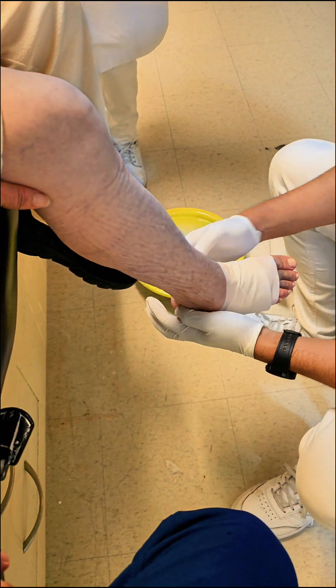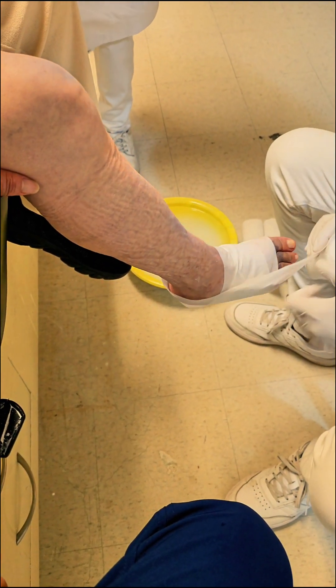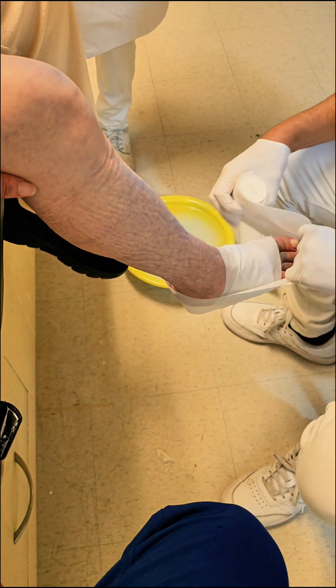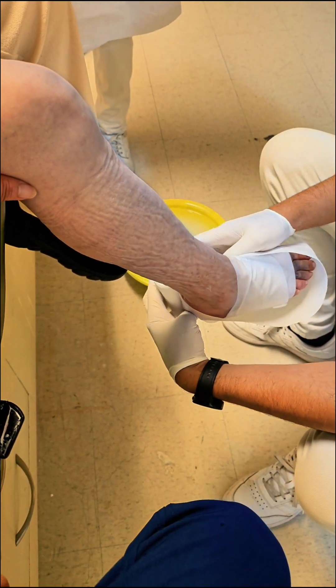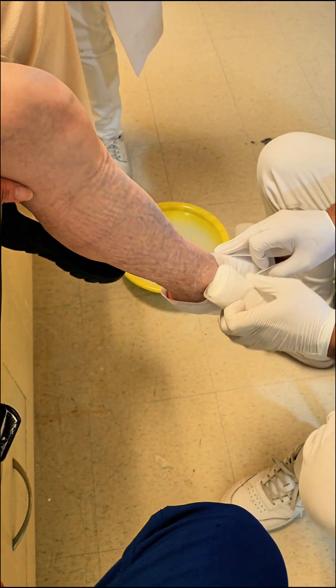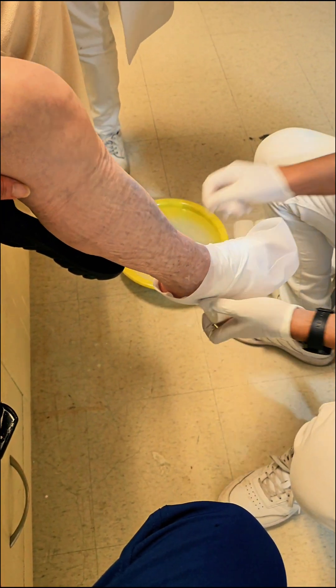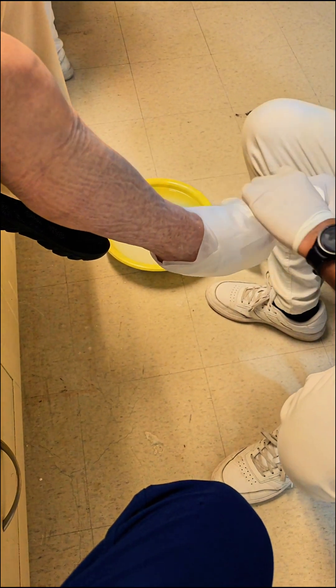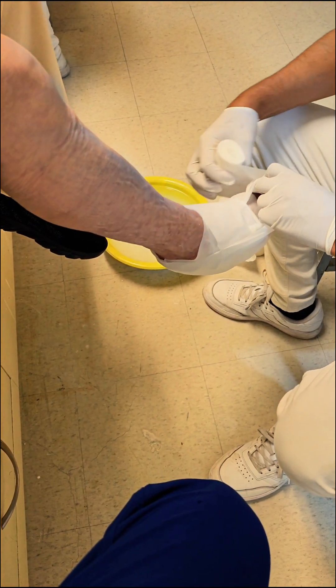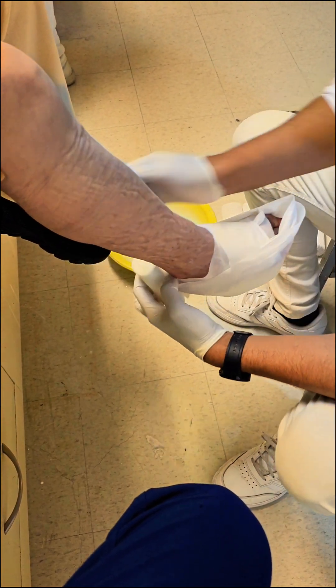Welcome back to the channel. Today we're diving deep into a crucial and highly specialized topic: how to properly apply casts for different types of foot fractures, specifically the suro pedaleco, huarache, and Swedish shoe casts. These casting techniques are essential for ensuring proper healing and providing the right support during recovery.